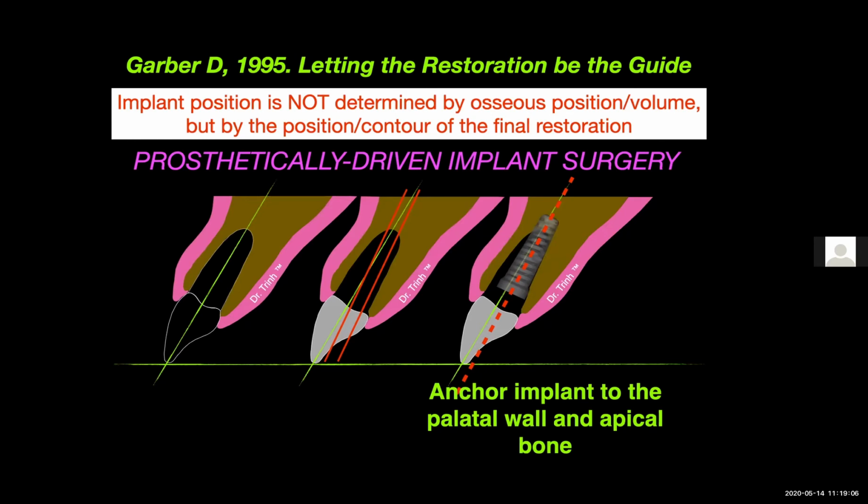This is because if the implant position does not properly support the aesthetic and functional requirements, then the implant is relatively worthless. They also advocate for a screw-retained anterior implant restoration, because a screw-retained anterior implant basically means proper implant position, which means that we have the ability to preserve hard and soft tissue long-term and short-term, as well as the ease of restoring and maintaining peri-implant hygiene over time. The benefit of having a screw-retained restoration far outweighs the benefit of a cement-retained restoration. And really, this concept is widely accepted in the literature, both by surgical and restorative colleagues.